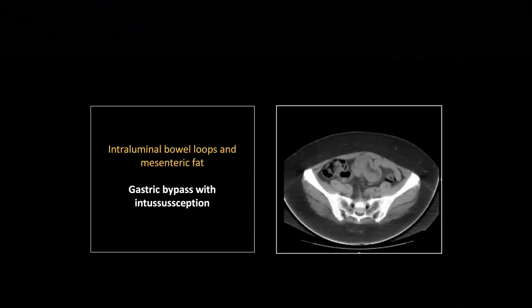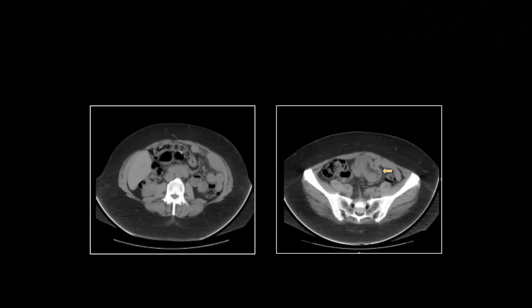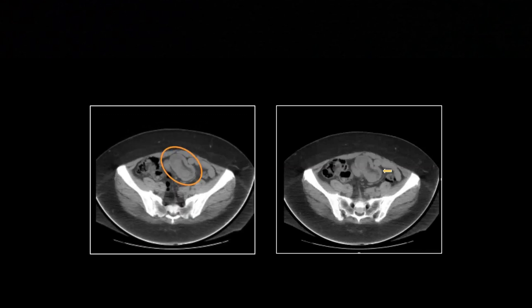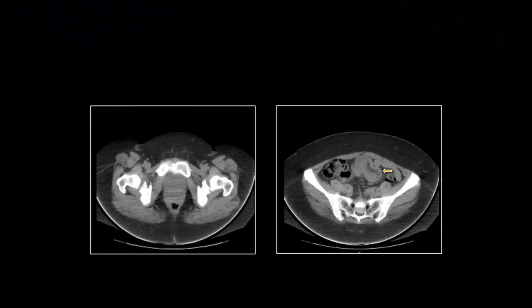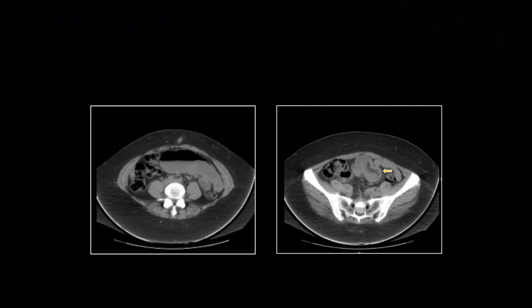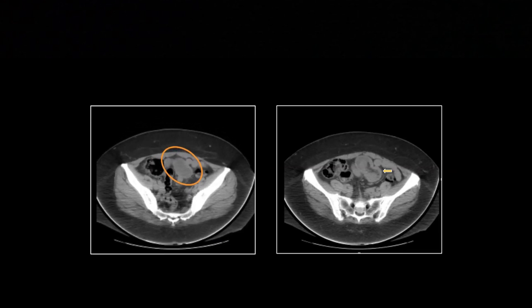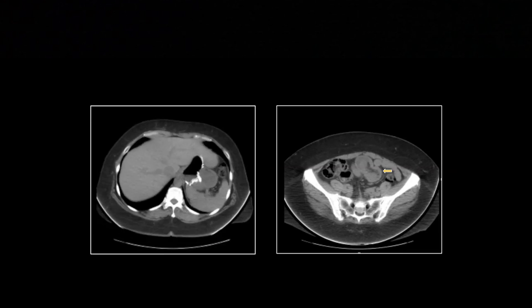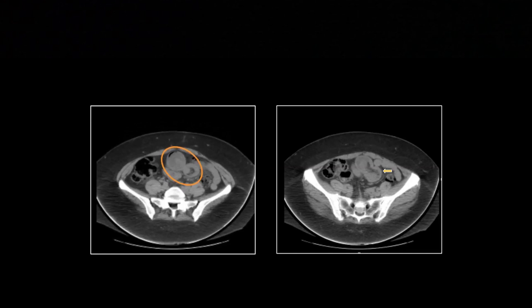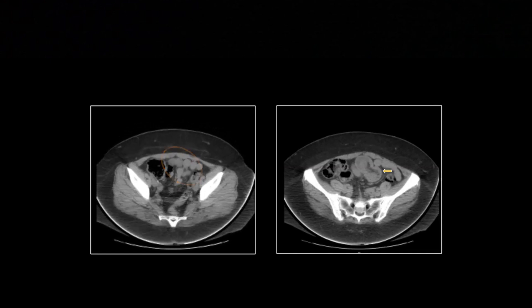This is a gastric bypass with intussusception. You can see a bowel loop with mesenteric fat and vessels within a larger dilated bowel loop. People with anastomoses tend to dilate at the anastomotic site, predisposing them to intussusception. You can see fat within the gut lumen — always a sign indicating intussusception, though obviously not a good sign for the patient. You can also see the dilated bowel at the anastomosis setting this patient up for that phenomenon.